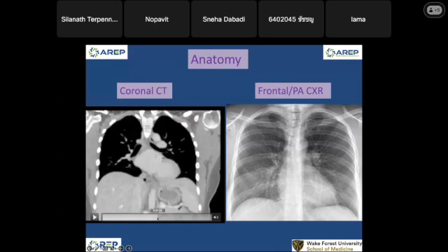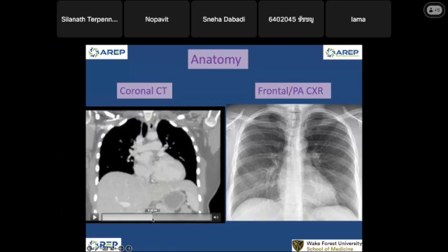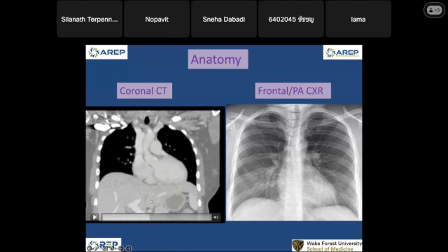I'm going to show you a bit better here. So this is my left ventricle. This is my mitral valve. From the left ventricle, it will go out into the left ventricular outflow tract. This is the left ventricular outflow tract here, and this is the aortic valve, and this is the ascending aorta. So the ascending aorta is feeding our body.